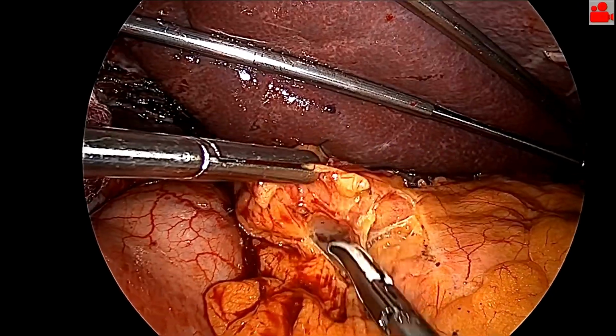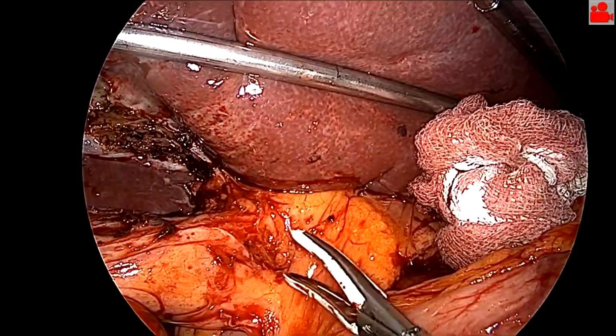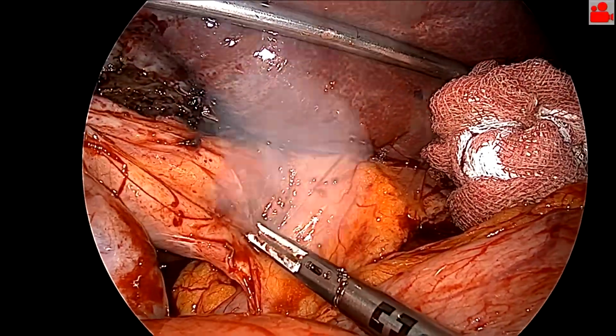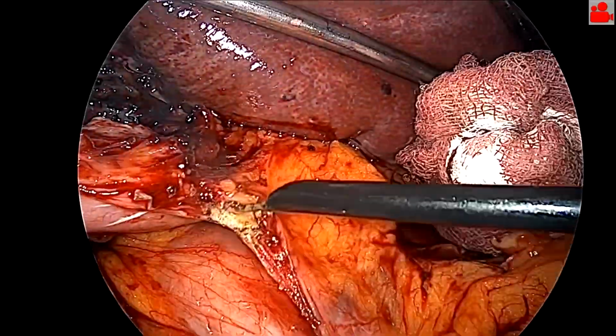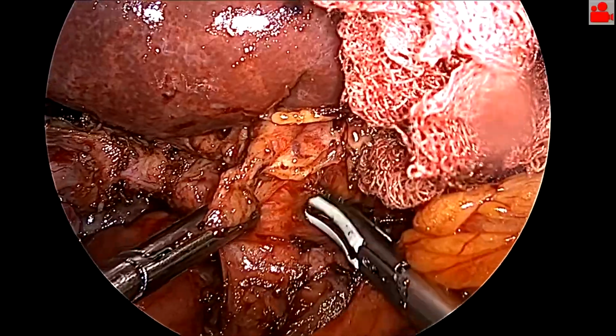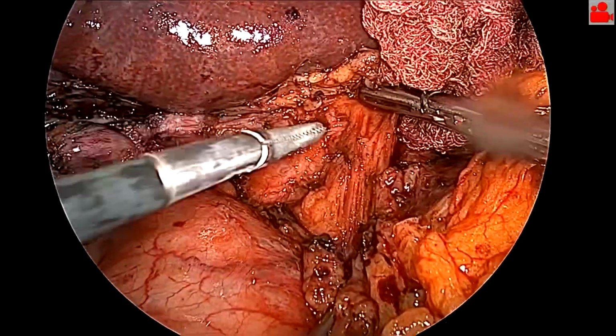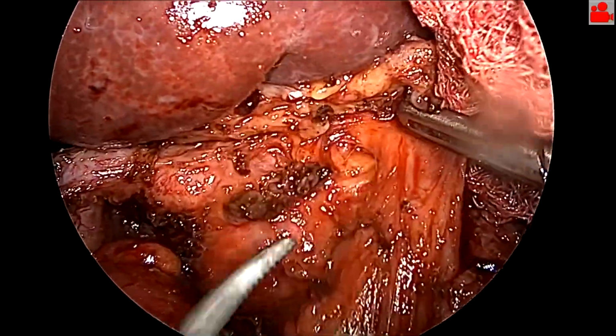During dissection, we noticed an enlarged lymph node in station 8A, and we perform its excision. Afterwards, we continue the dissection within the hepaticoduodenal ligament, using an energy source and blunt technique to mobilize the proper hepatic artery, with performing its isolation using a vessel loop.